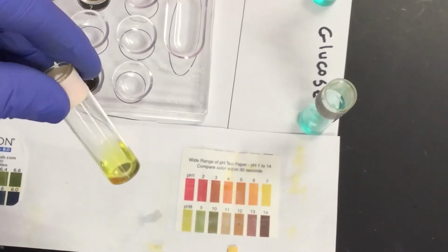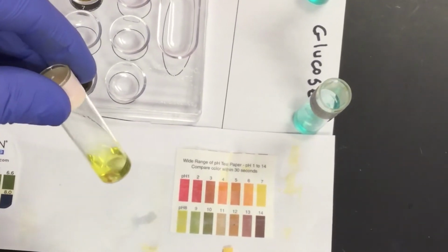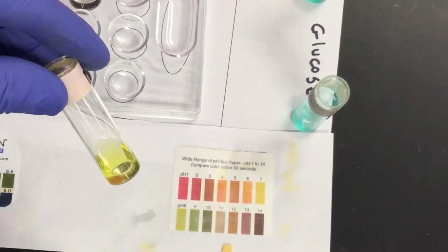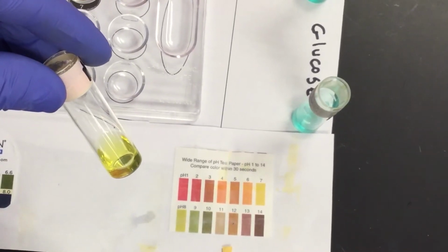Clarity relates to, am I able to see through it? Is it clear? Or is there any type of cloudiness or turbidity to it? Okay, so that's your first little part. You should have your first two parts of your data chart filled in.